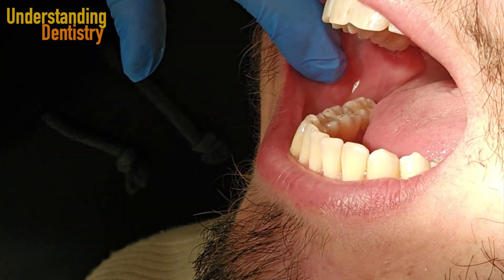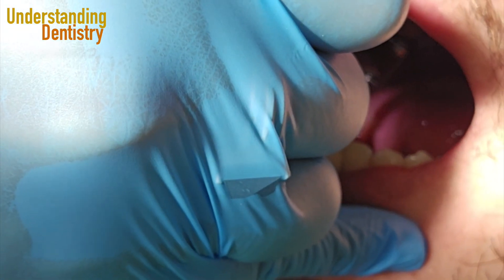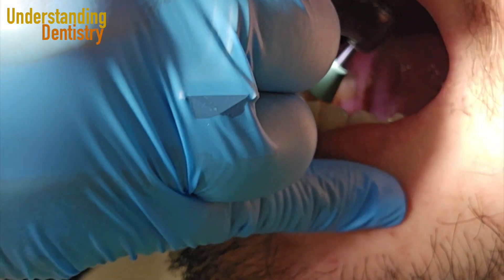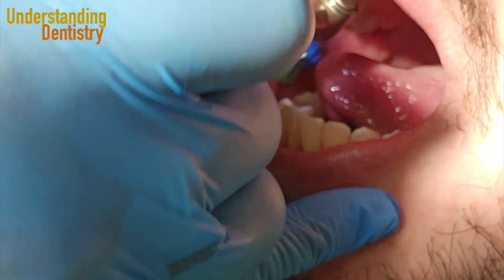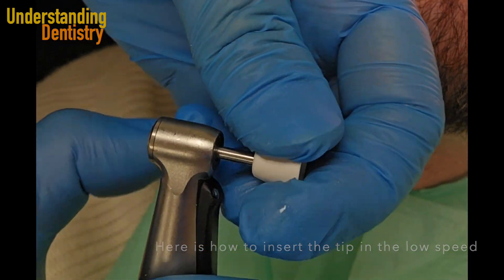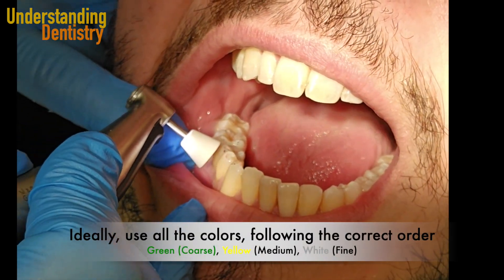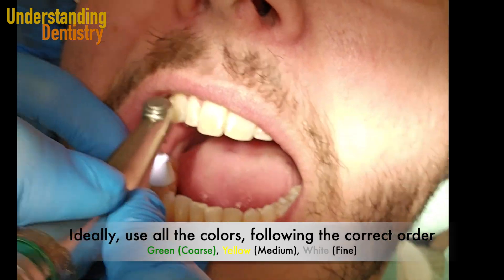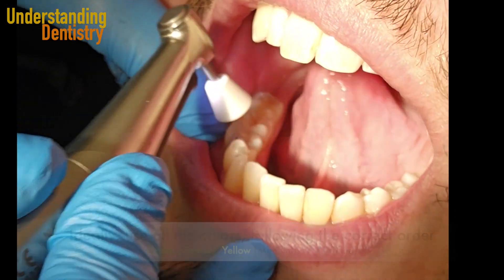You need to choose one of the colors depending on the degree of polishing that you need. Here we are using the green one first to adjust some cusps — and of course that's the cup shape. Why do you have different shapes? Because this is useful for different surfaces. So you are going to use this with different colors to make sure that all the surfaces are smooth for your patients.